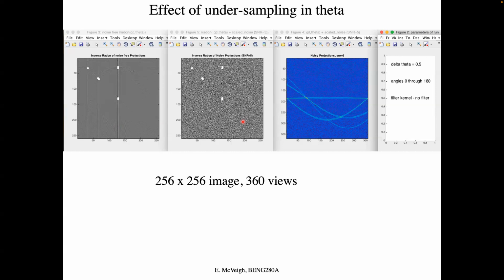But then the other question is, we're going to run out of what? Well, we could run out of memory. Yes, it's true. There's something else we're going to run out of in each projection, though. And this is a fundamental thing. If you remember anything about CT, this is a really fundamental thing. We run out of signal. What is the signal? Photons, right?